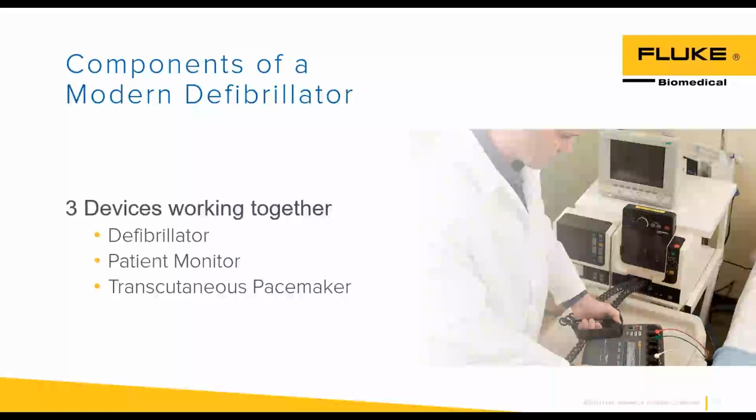How about data communications and data recording? A lot of these AEDs and defibrillators are going to record everything that's going on, not just the ECG strips, but a lot of them have microphones, and they're recording what's going on in the background. Some of them you can tag drug libraries into. Additional features: battery maintenance. We'll talk more about that in some more slides. But some defibrillators, you can't just plug into the wall and charge every time. You have to take that battery out, take it down to a docking station, wipe the battery memory out and reprogram it.